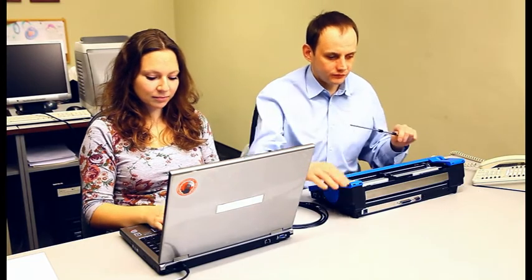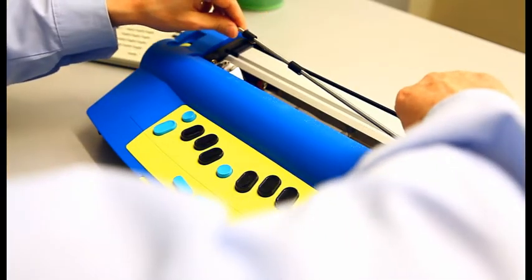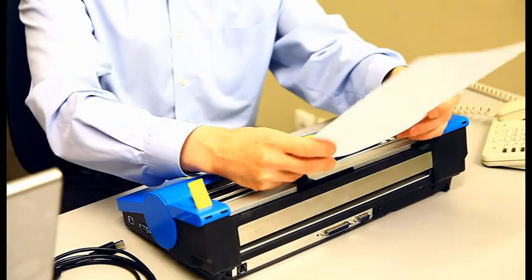The paper bale that is normally removed can be reinstalled for embossing — it helps the paper stay in place. Lift the paper lever up, move the right margin adjuster all the way to the right, and put the paper bale in. When you have put your paper in, readjust the right margin.